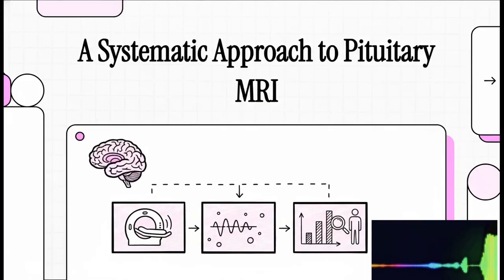All right, so you're an endocrinologist, and a pituitary MRI lands on your desk. It can be like looking at a tiny, complex puzzle, right? The signals are so subtle, the anatomy is all packed in there, and honestly, the stakes are super high. Well, today, we're going to hand you the cheat codes.